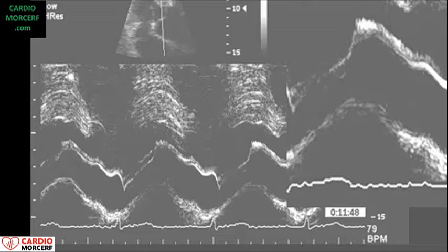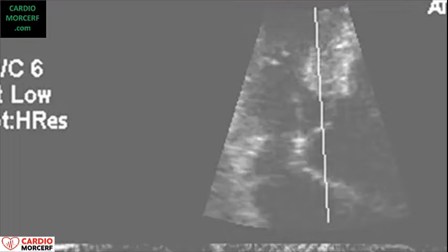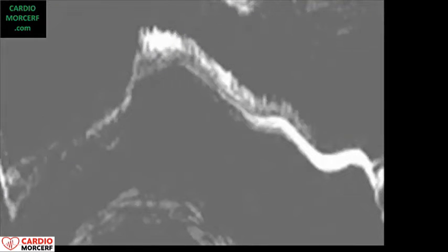Look at this aortic valve. 2D echo normal, no vegetations seen in a patient with clinical suspicion of endocarditis. A thorough M mode scan of all valves was performed. The aortic valve presented the classical torn paper sign. This here may look like a smudge, but it's too thin to be sure. Watch the border of the same valve where there is no vegetation, how smooth it is. Completely different from what we see here at the vegetation.